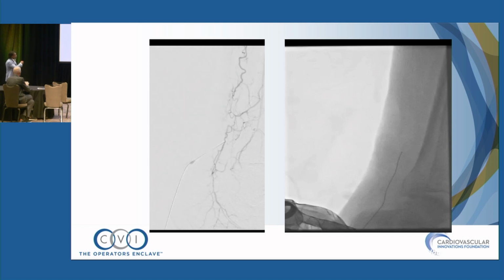I just did that to demonstrate where it would be, but we usually just do it under fluoro. And then this is the most important thing. Once you get access, what we usually do is put our needle in under fluoroscopic and ultrasound guidance. You wire it with a non-hydrophilic wire, and the reason that's important is because that's going to give you that tactile feedback. If you use a hydrophilic wire, you don't get the tactile feedback.